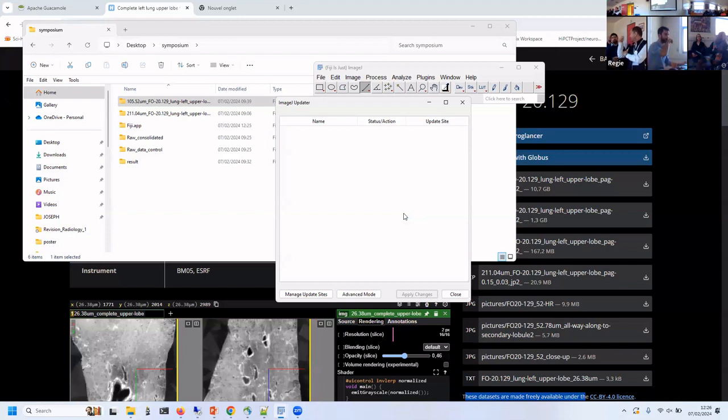As soon as that's done, we'll flip to Zarr. Because then the user would not have to download anything directly. Yes, absolutely. It's a goal. Very good suggestion. And please ask for multi-levels. That's what people ask. Yeah, that would be great.